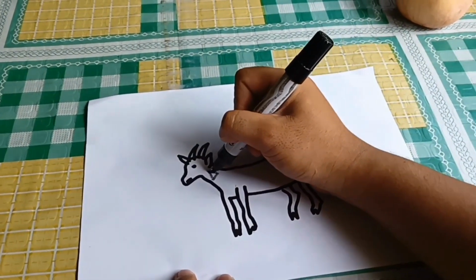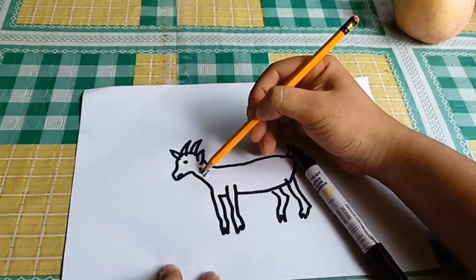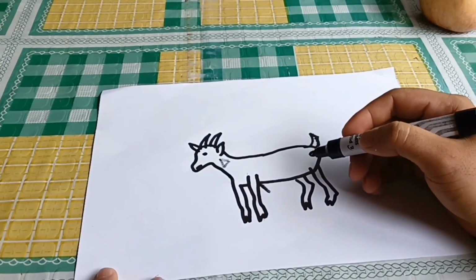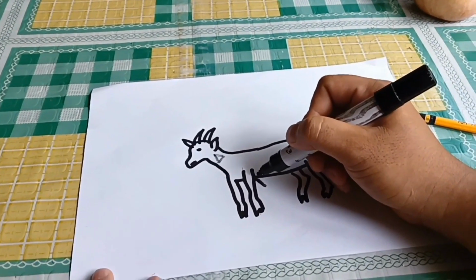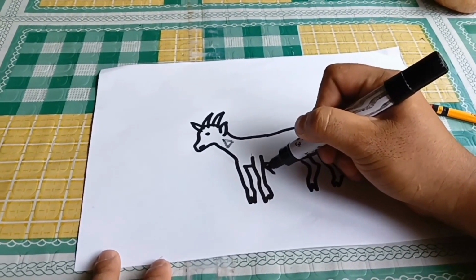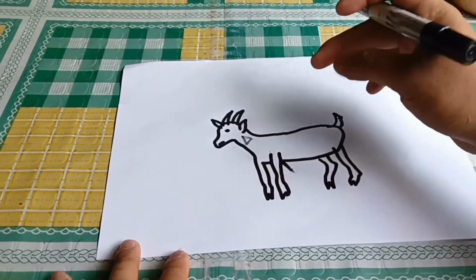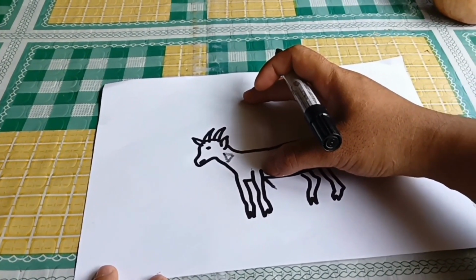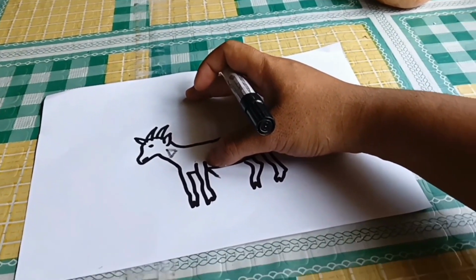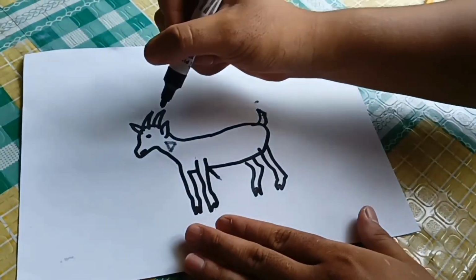Then at the middle, this part will be the site for the intramuscular injection. For the subcutaneous injection, you're just going to inject it at its armpit. This is the armpit of the goat. You are just going to stretch the loose skin of the goat so that you will be able to inject the subcutaneous injection.